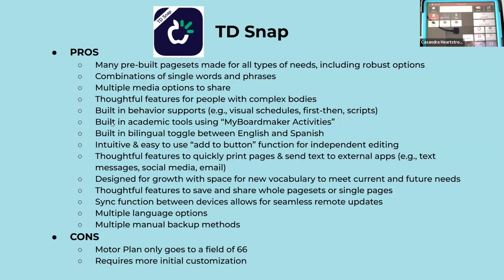There's built-in academic tools through my BoardMaker activities. Hopefully this loads for me because I don't know if I'm logged in. Yes. Addition and subtraction things. It's loading. 50 plus 3 equals. So you can load different academic activities in here. This is especially great for the kids who don't want to release the device from their hands. You can do math and morning meeting.